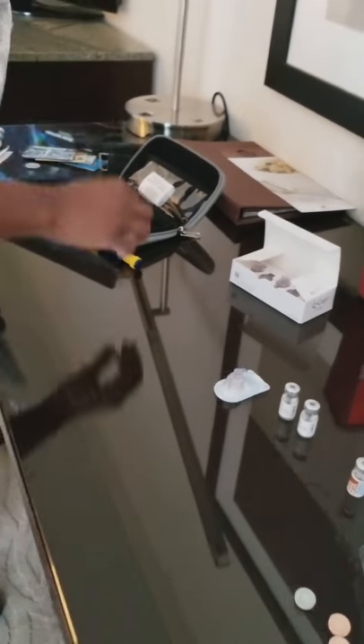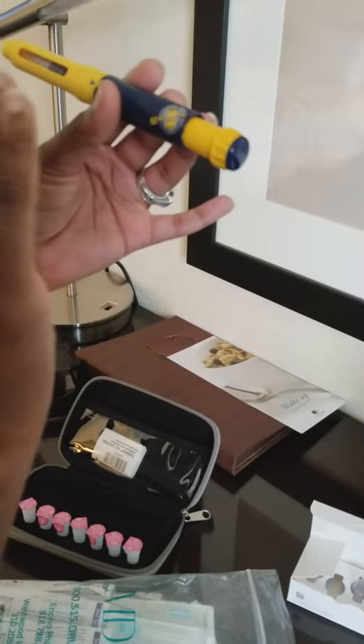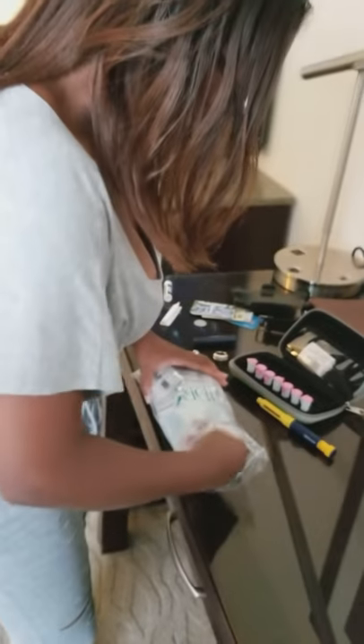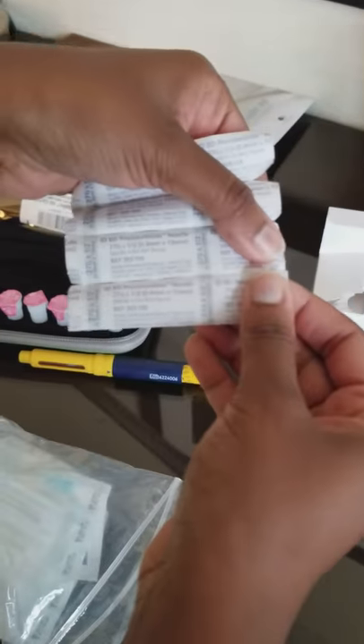She also is on 225 of Follastim. So we turn it until it reaches 225 — it comes out so it will give us the exact amount needed for her Follastim. And then we take out a one and a half, 27 and a half needle.